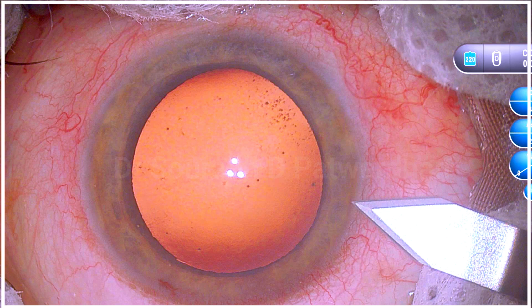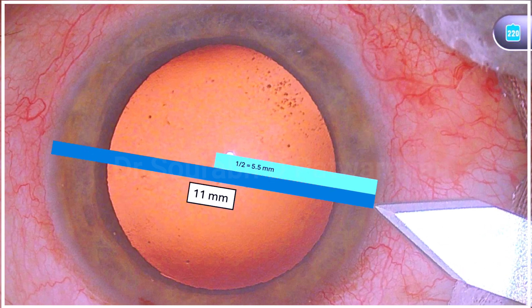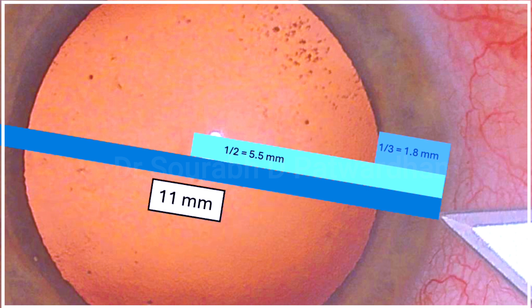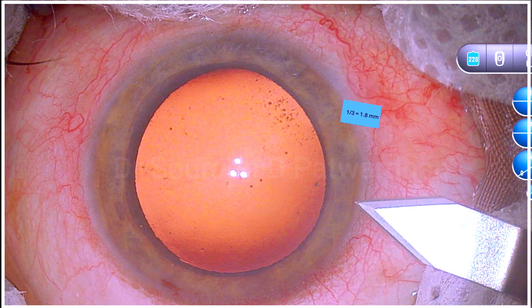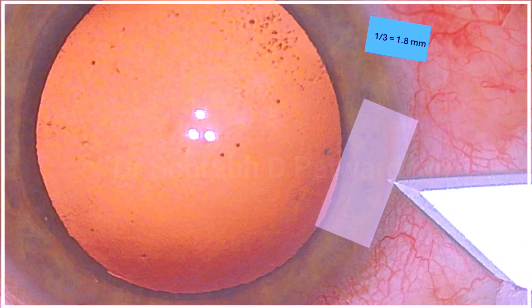I tried to decode how I am recognizing that pattern. I know that the length or diameter of the cornea is 11mm, half of that is 5.5mm, and one third of that is 1.8mm — and that is the length I want to achieve. I don't want it too short, otherwise the iris will prolapse.